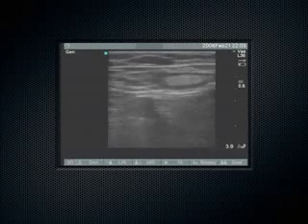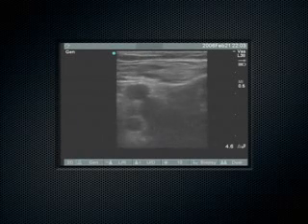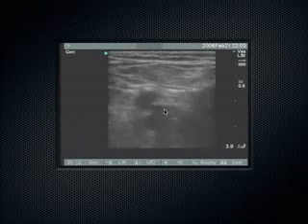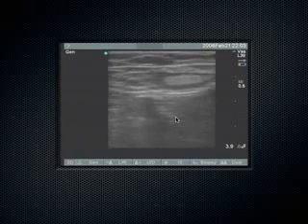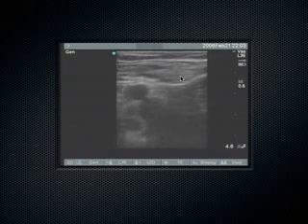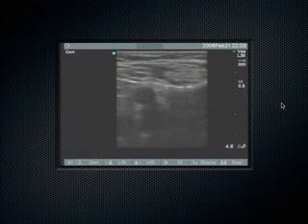So how about this? Which leg is this? Right leg, because this is the femoral artery here, and there's the femoral vein compressing down there. What the heck is that up here? That's what was drawing my eye. And the first time I saw that thing, I didn't know what to make of it. I thought the patient had DVT.